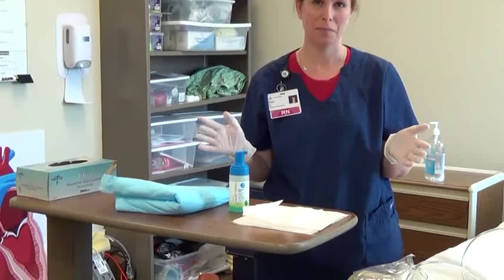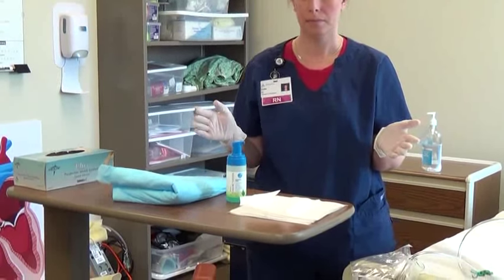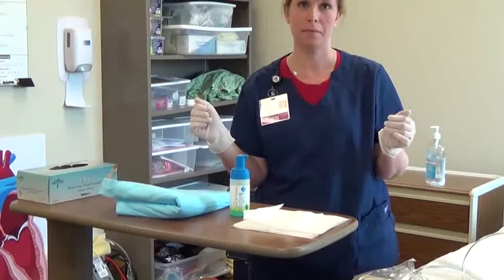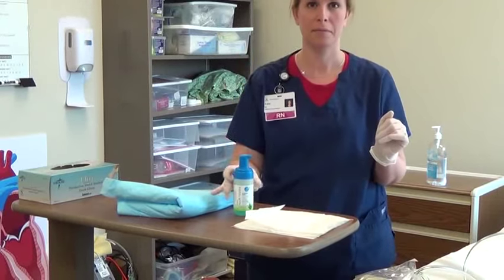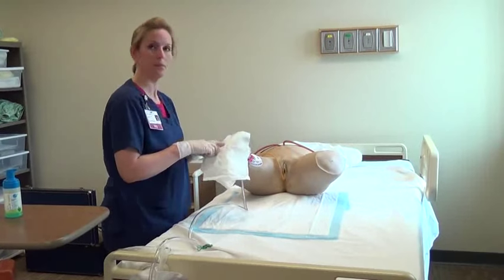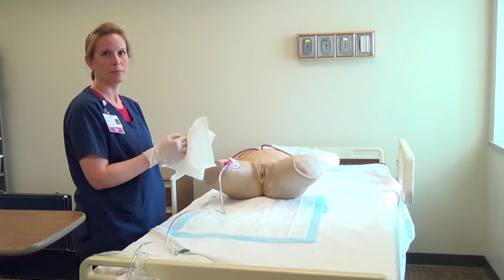To begin Foley catheter care, supplies that should be gathered include a garbage can, Chuck's pad, clean gloves, 5 disposable wipes, and the foam cleanser. Perform hand hygiene. If you haven't already, perform hand hygiene and don clean gloves.